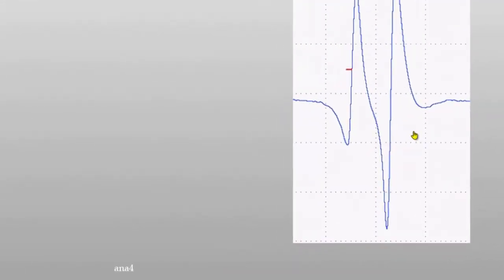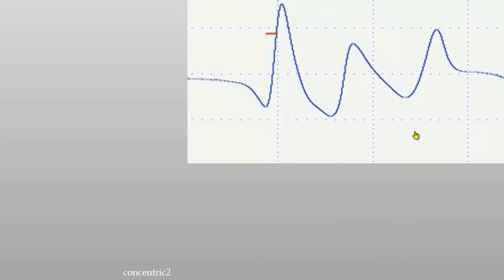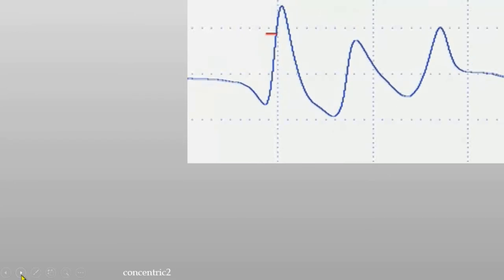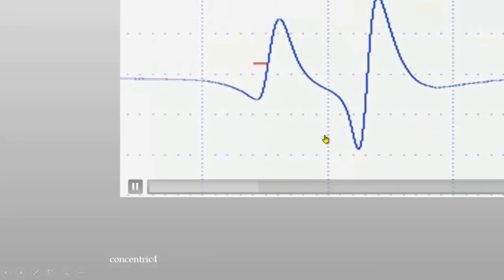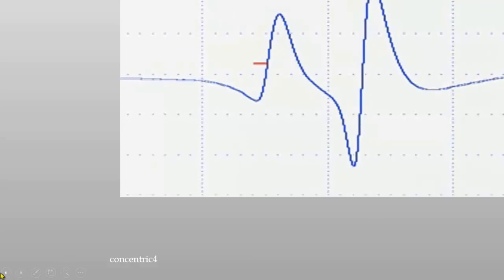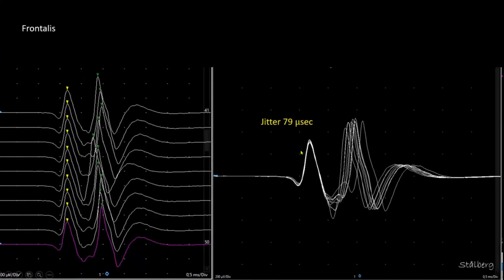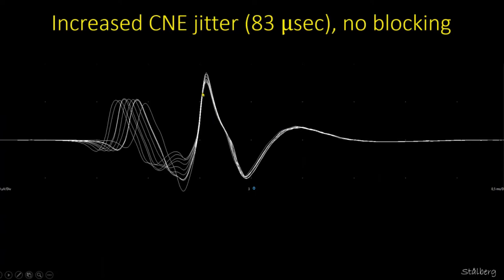Here is a single fiber electrode recording where the signals rise with a parallel shape, constant in shape but variable in latency. Here is a recording with a concentric needle electrode showing the same principle. In another concentric needle electrode recording, we trigger here and see the variation of the second potential. In raster mode, triggering on the second one shows a large jitter — this is increased and abnormal.